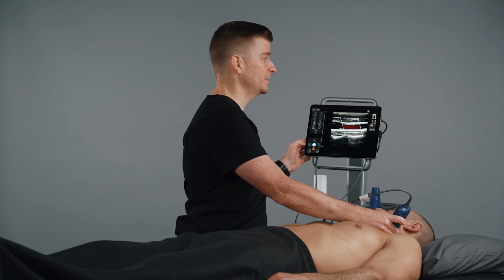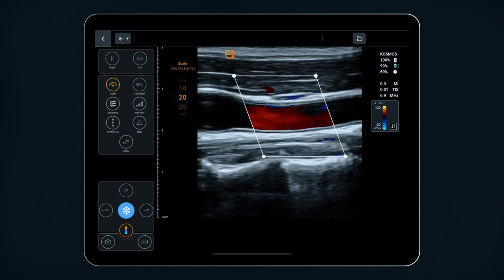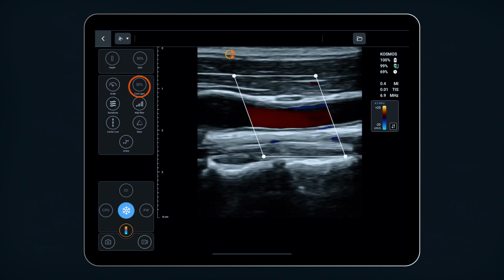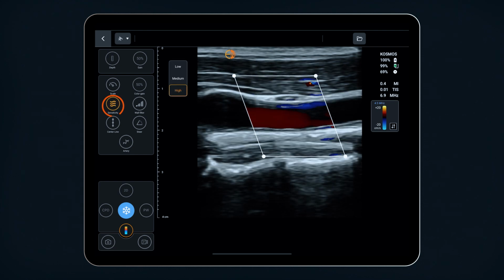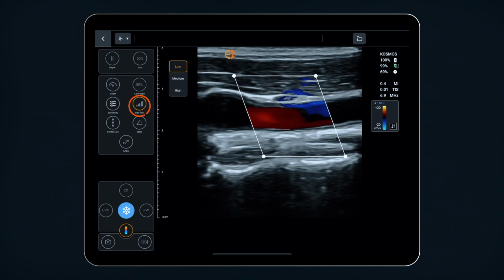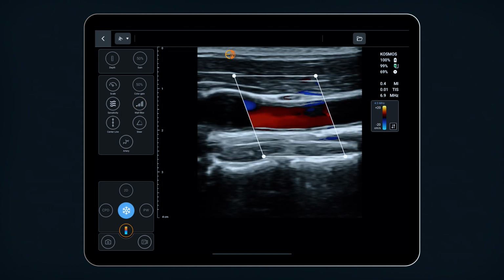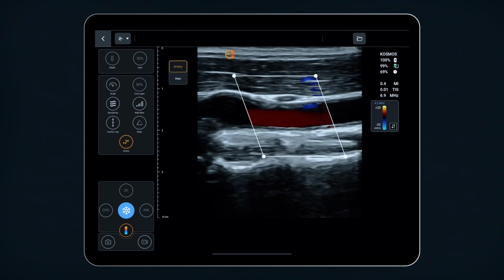You can again optimize Color Doppler by adjusting the scale to capture different velocity ranges, adjust the color gain to increase vibrancy, increase the sensitivity level, and adjust wall filter to reduce noise. Lexsa has the additional options to select artery or vein and steer.